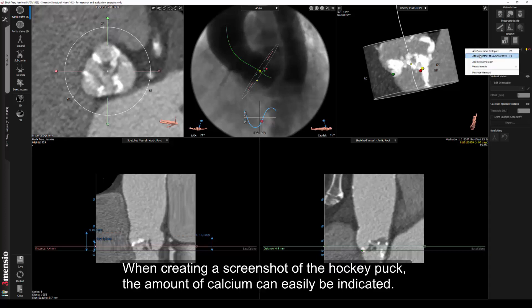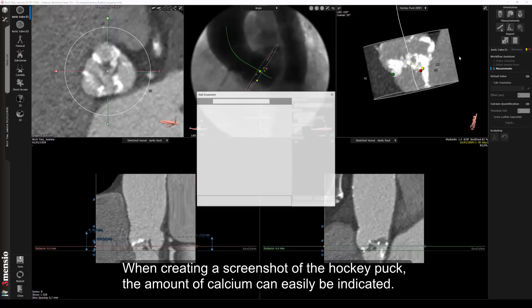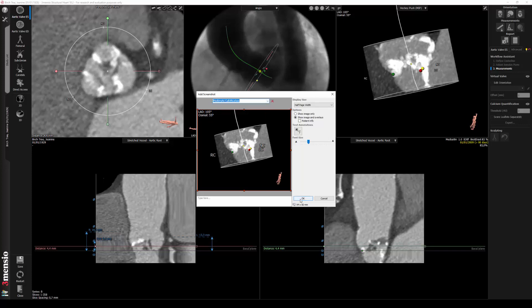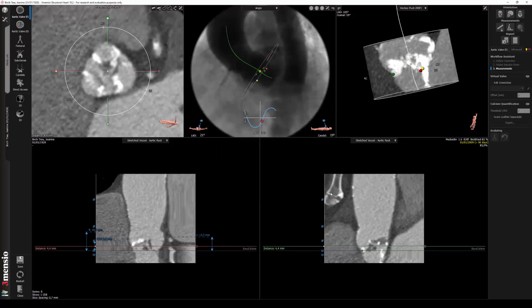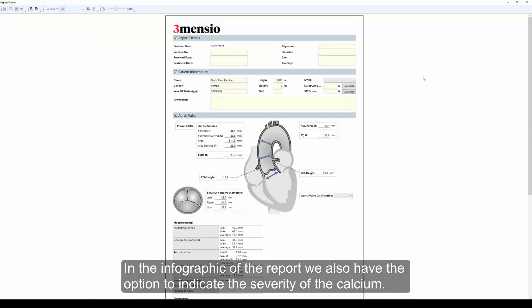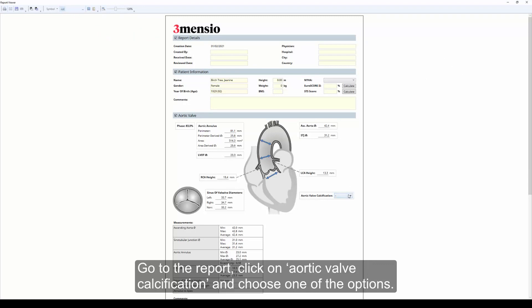When creating a screenshot of the hockey puck, the amount of calcium can easily be indicated. In the infographic of the report, we also have the option to indicate the severity of the calcium. Go to the report, click on aortic valve calcification, and choose one of the options.